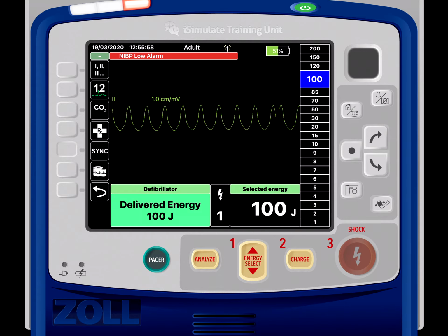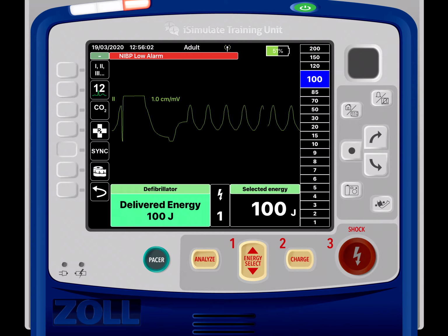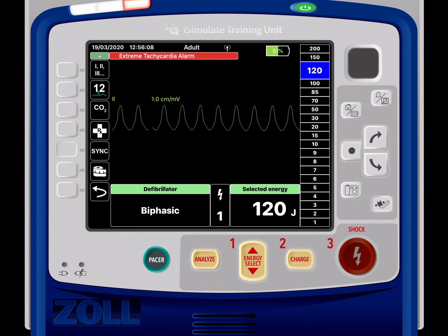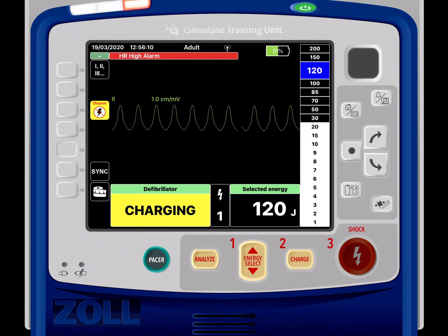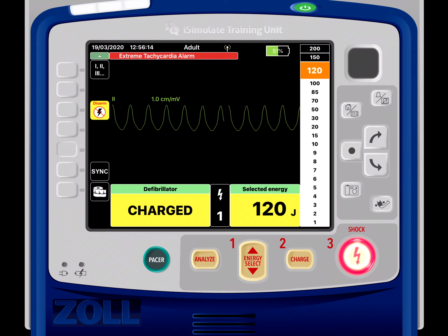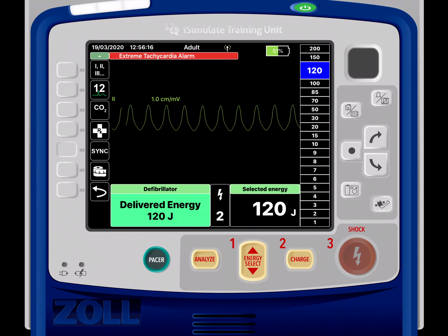Remember though, you have to hold down. There we go. Alright, so our wide complex tachycardia persists. There's no change in our patient presentation. We're going to go up a step here. Charge again. Alright, clear the patient. Deliver our energy.